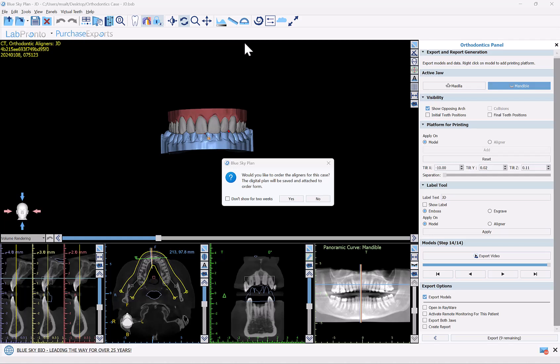Now we're at the export phase where we can export the models for aligner manufacturing. A dialog box comes up automatically asking if you would like to order the aligners for this case. If you would like to have the aligners manufactured for you, you can simply click yes — a form comes up directly on screen, the relevant files will be automatically attached and sent with your order to manufacture the Pronto Aligners.